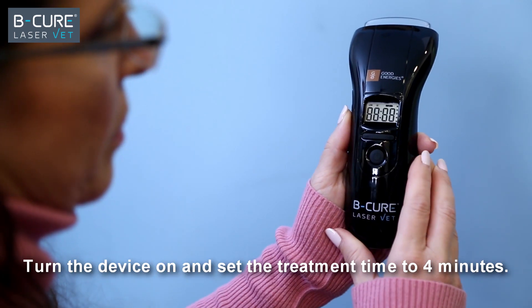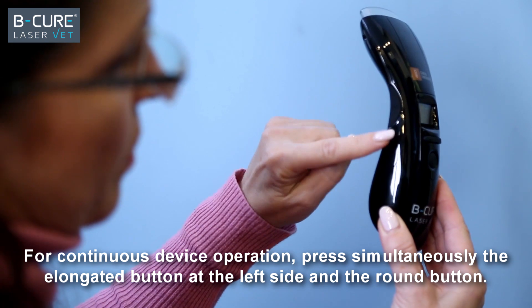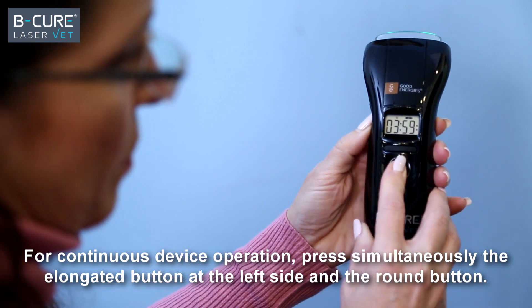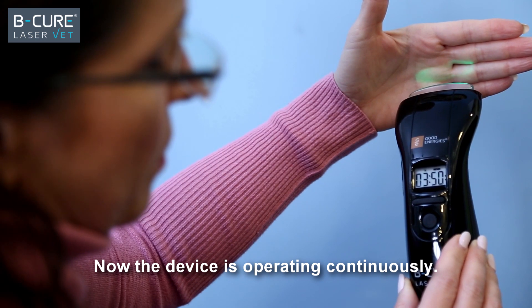Turn the device on and set the treatment time to 4 minutes. For continuous device operation, press simultaneously the elongated button at the left side and the round button. Release both buttons simultaneously. Now the device is operating continuously.